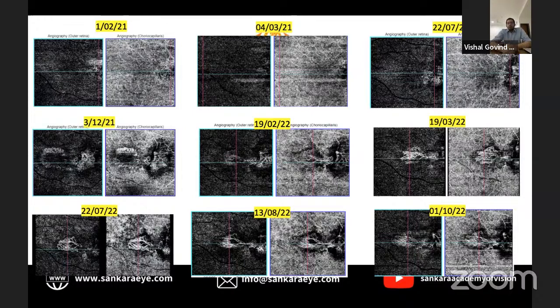We also had an experience, albeit in a patient with angioid streaks. We did a focal laser for an extrafoveal lesion, and that ended up recurring and became a big mess. So I sort of am scarred on those lines, and I wouldn't use focal laser too often. I would tip towards anti-VEGF if I had to treat. And like I said, for transpupillary, I have nil experience, so no comments on that.